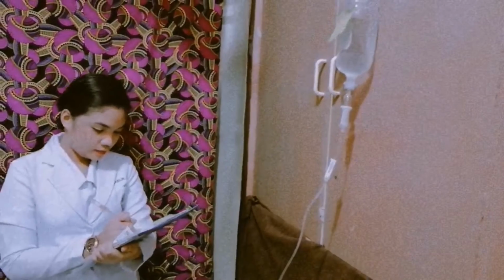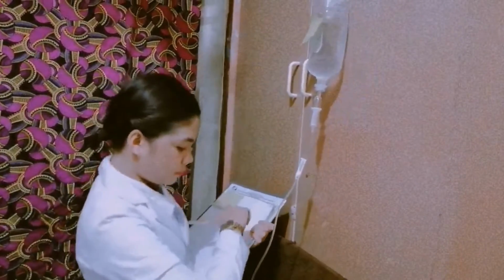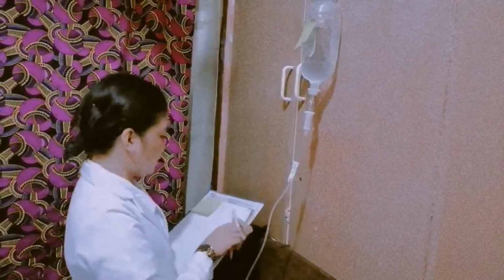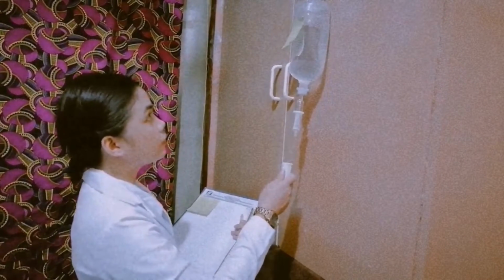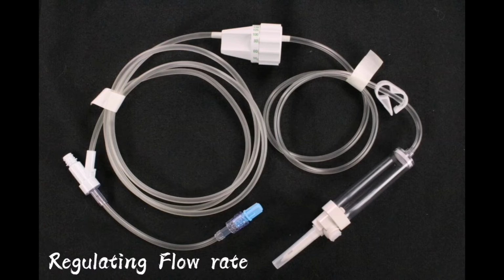And the last procedure is to monitor periodically, at least every 30 minutes, to check flow rate and observe for infiltration and other untoward symptoms. This documents the client's response to the infusion. The second process is regulating flow rate.